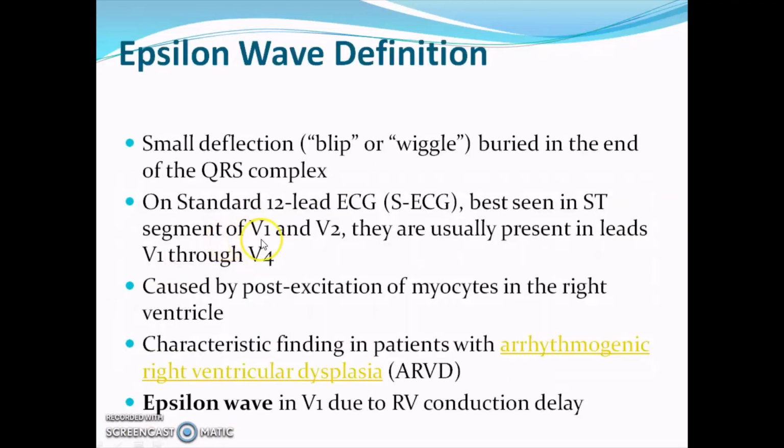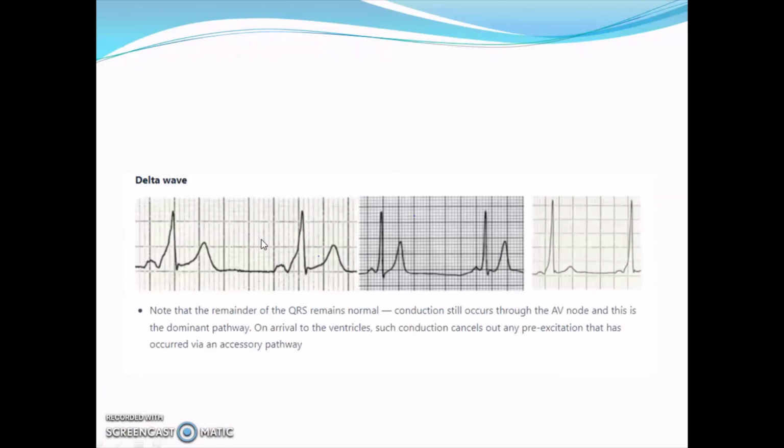So here, in this ECG you see the QRS complex's initial wave is slurred.